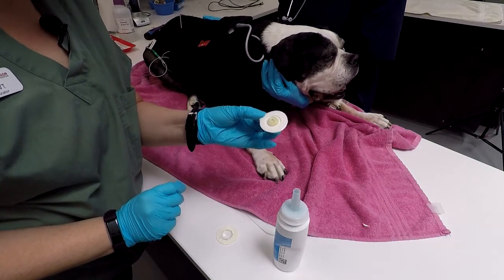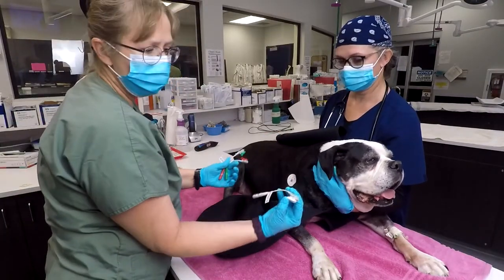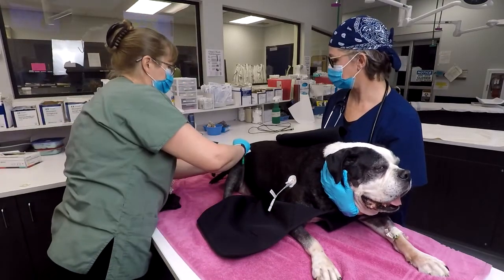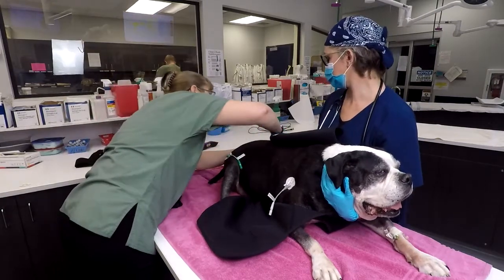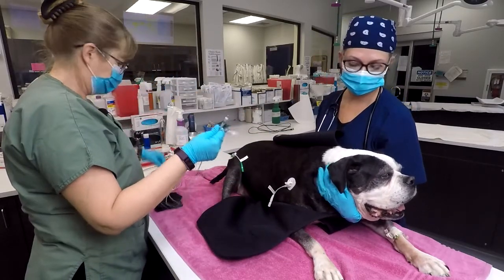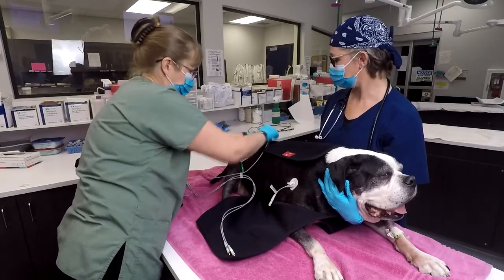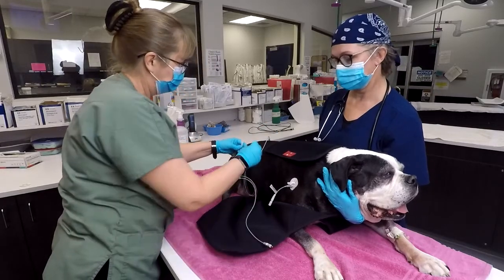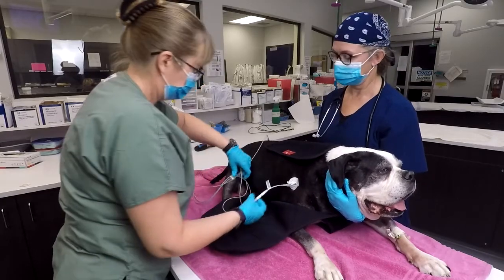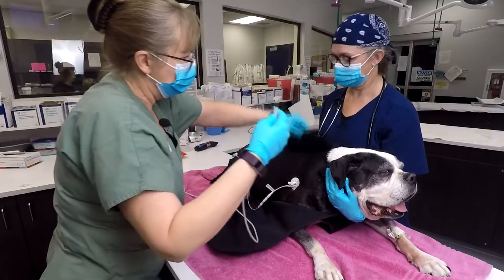With the electrodes attached, go ahead and attach the leads to each one, paying attention to color codes: white is right front, green is right rear, and red is left rear. These stay on quite nicely. Then attach the remaining leads, again paying attention to color coding.